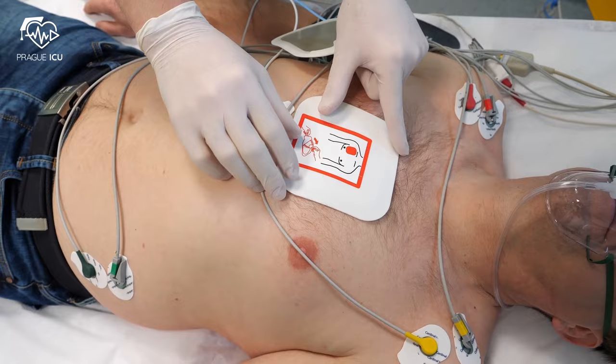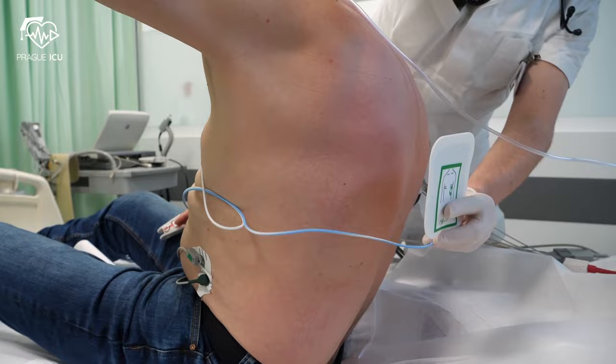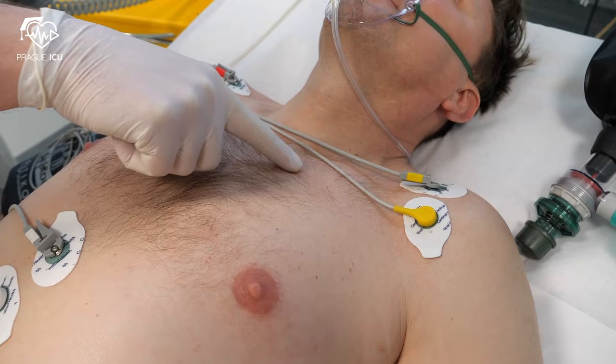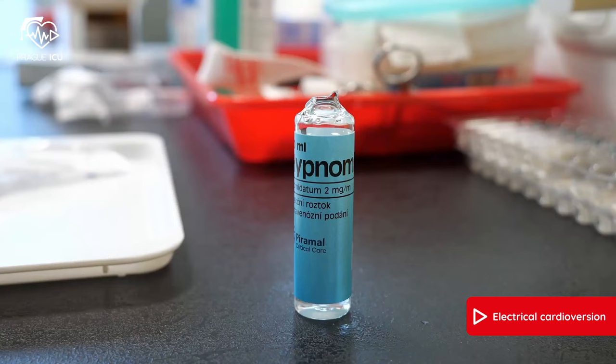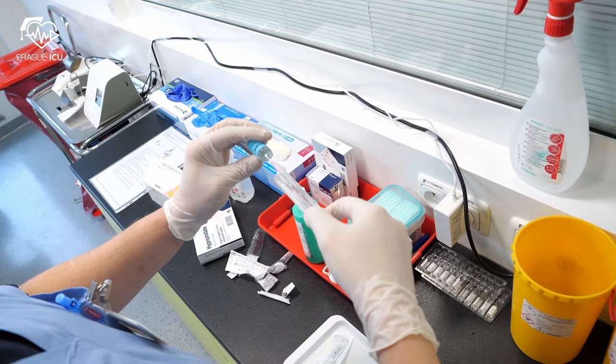You can use the more common anterolateral or anteroposterior position of electrodes. Place electrodes at least 5 to 8 centimeters away from any pacemaker or implantable defibrillator.